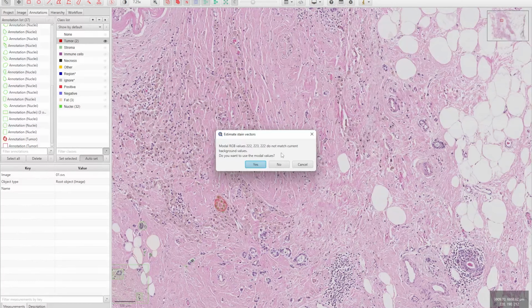So simply, we can, here in this application or using a scripting language like Python, find the vectors using this tool for hematoxylin and eosin and propagate those vectors to all of the other images so that we can ensure that all of the images have the same vectors. This will help to reduce the variability, because you may gather data from different places or different scanners, which may have different settings or protocols, and hence each of them will have different vectors. But by unifying those vectors, you will improve the reliability of your project.